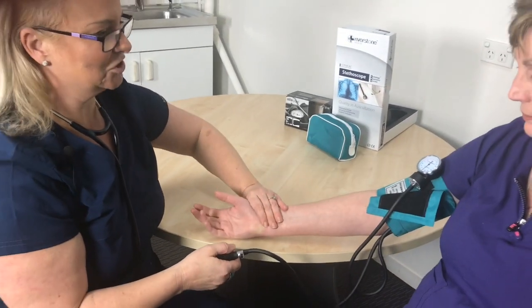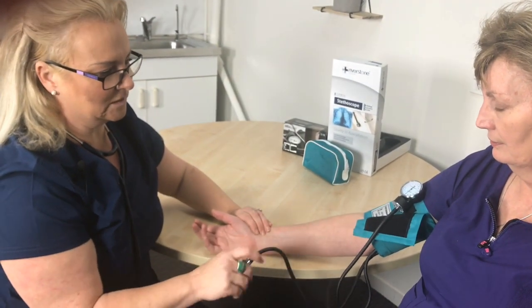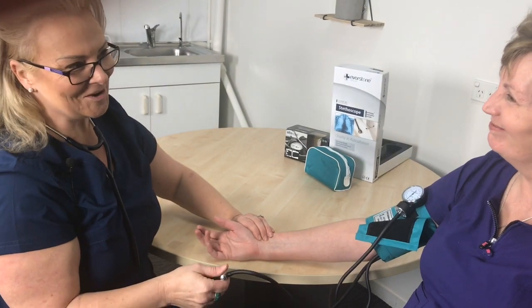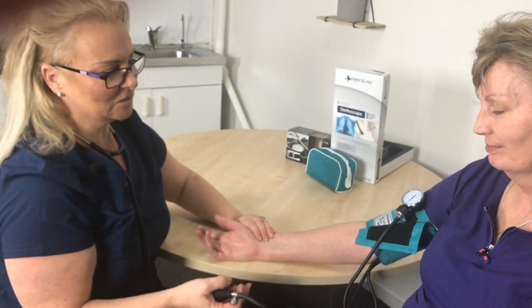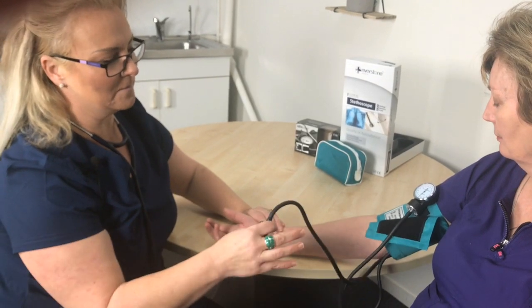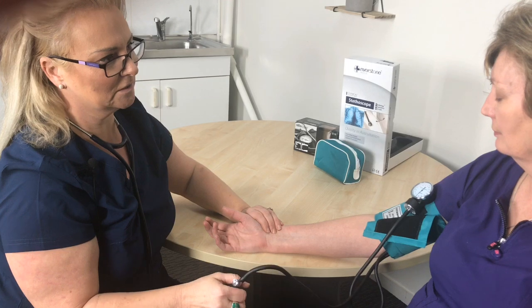Get your patient to turn their hand over. We want to feel for the radial pulse, and as I pump this up I'm going to look at the gauge. Normal is around about 120 to 130, but I'll pump it up to 160 and see how we go. When I feel the pulse disappear, that lets me know what the top pressure is going to be.